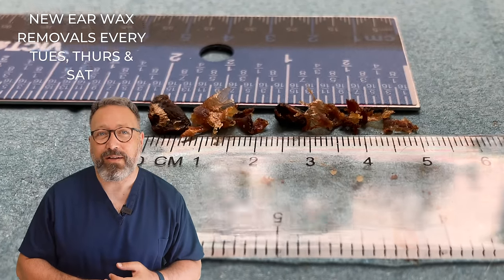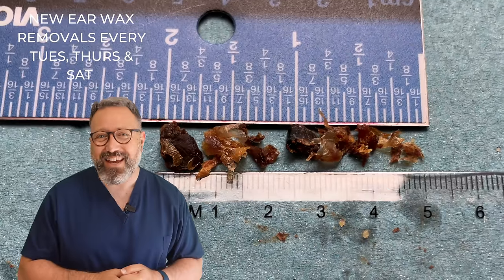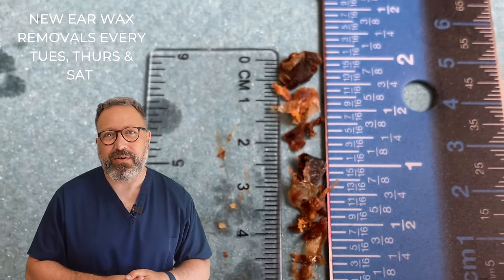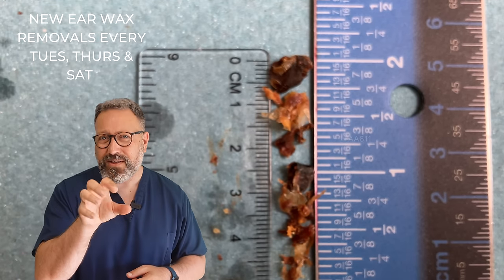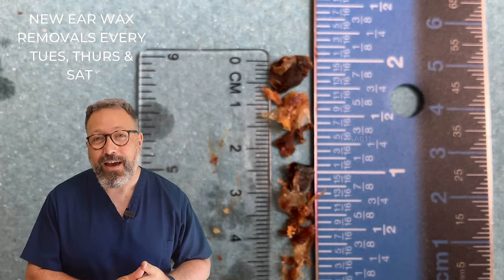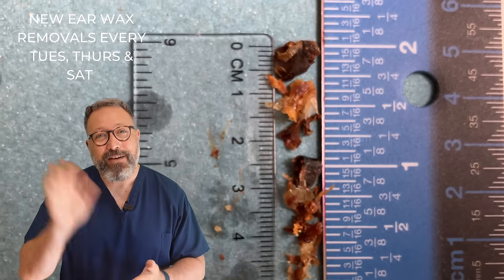This is what it looks like after — patient hearing a lot, lot better. We have five centimetres, two inches worth of wax and skin that we removed from that particular patient's ear canal. Quite a bit in there. You can see it there — quite a bit of skin holding all that in. Well guys, I hope you enjoyed that video as much as I did voicing it over. I shall see you again on Thursday. As always, take care of yourselves, take care of your ears, and take care of one another — I'll see you again real soon. Bye everyone.